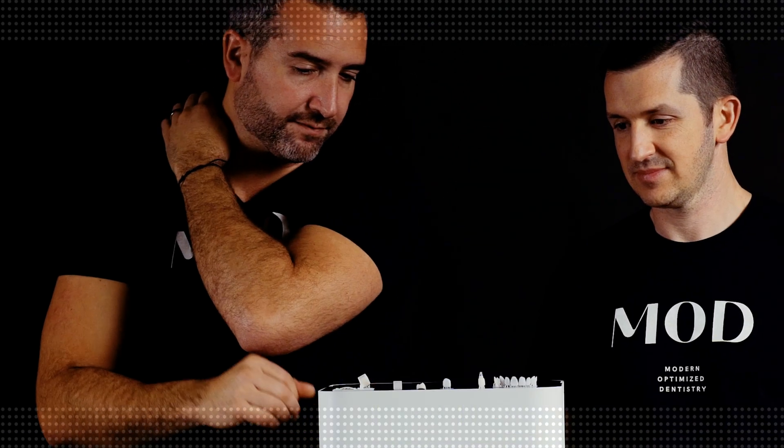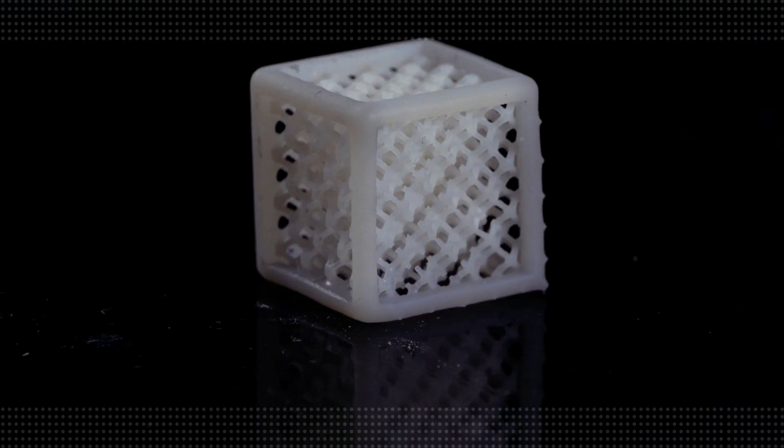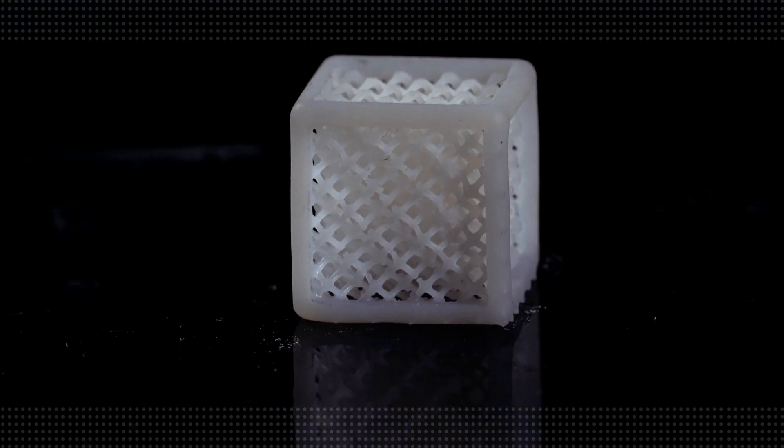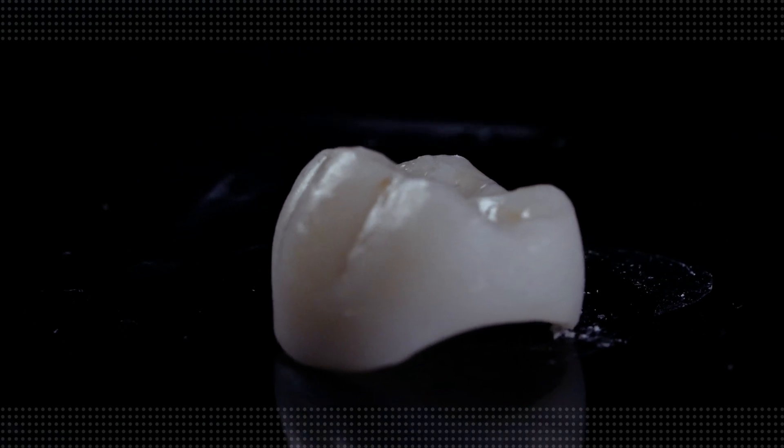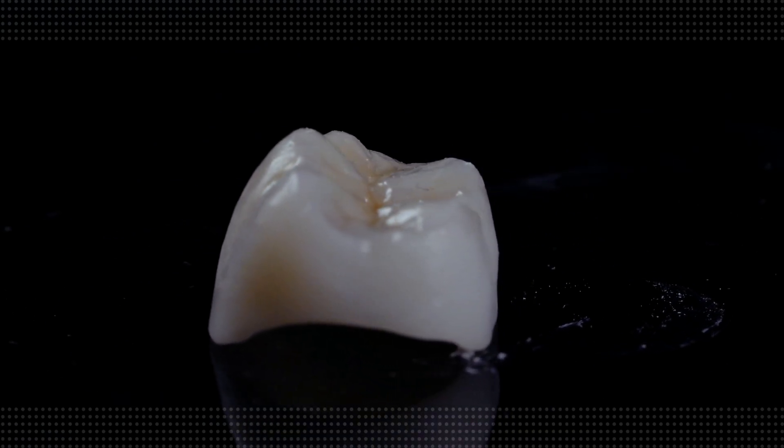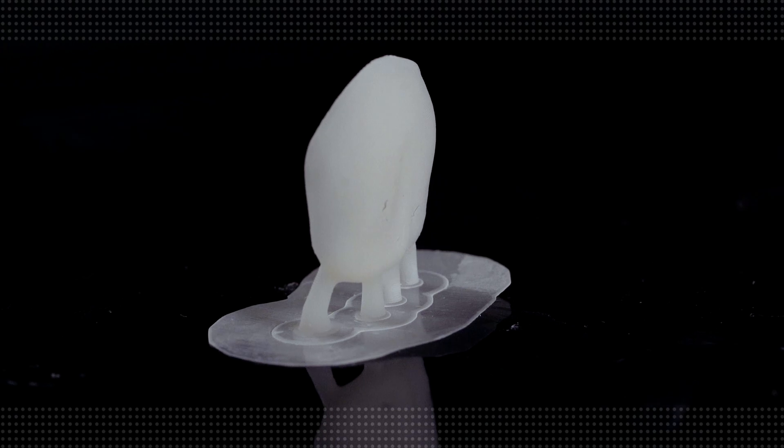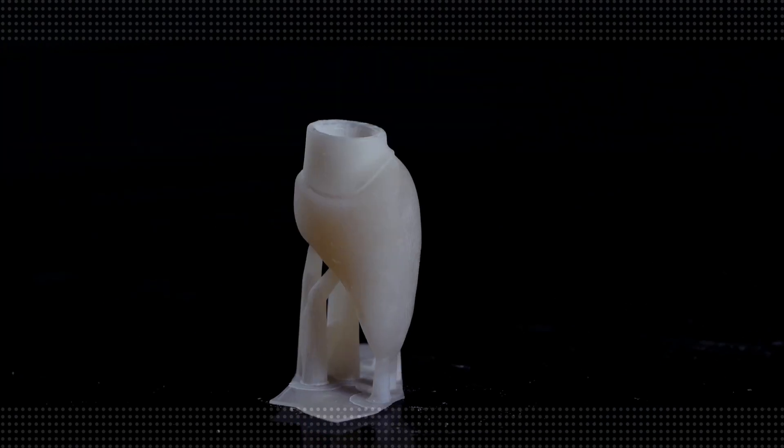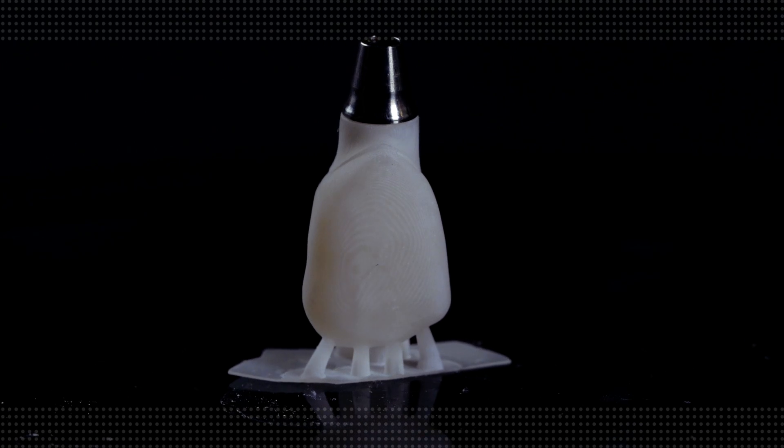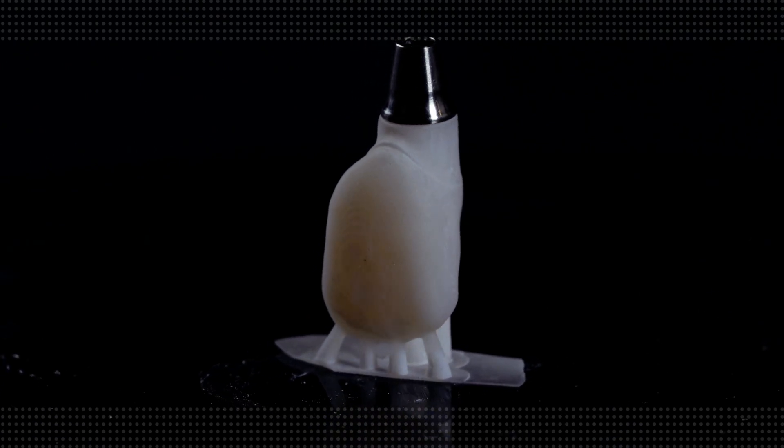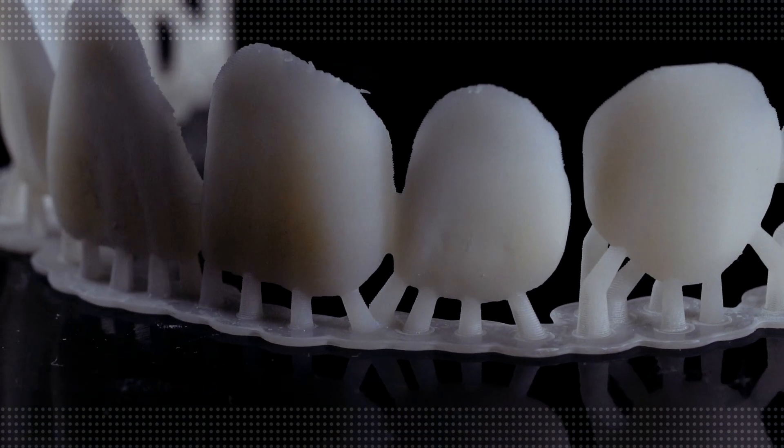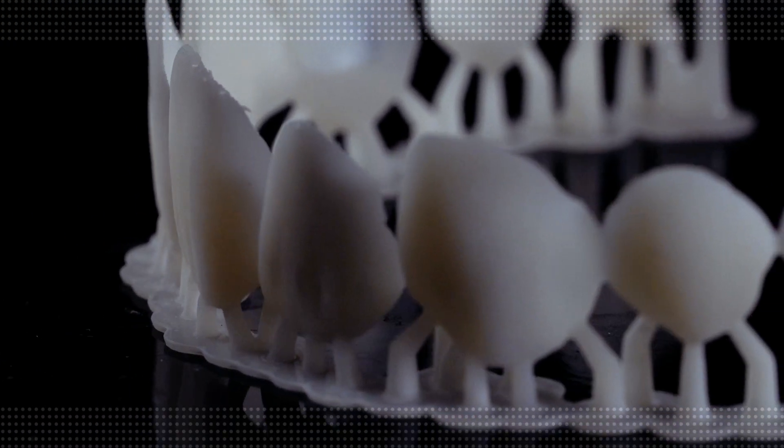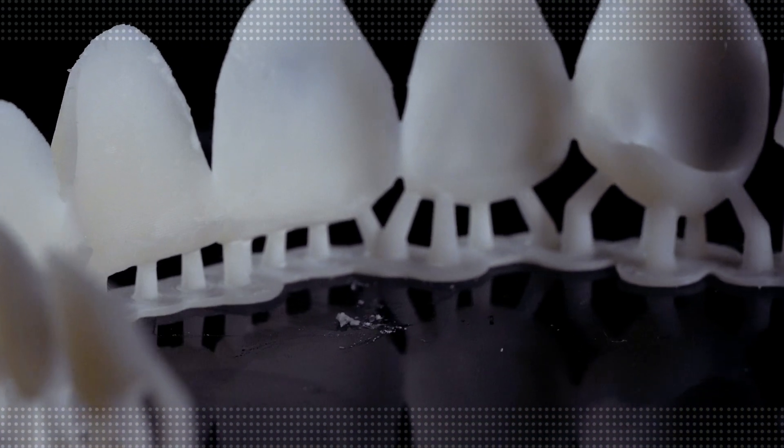The other four benchmarks we have are things that you'll be printing in your office every day. The first one being the single unit crown. Really what we're checking here is occlusal anatomy and margin crispness. Printed really great. The next is a single unit veneer, about 300 microns thick. We checked this on a test die. Perfect fit. So another great print. The third is an implant crown to a tie base. This is a true abutment tie base and we're looking at how well it could print to the anti-rotation notch. It was a perfect fit. We printed that 100 micron cement gap. And the last is a set of show mock-ups that we would print for someone who's looking to try in a new smile. Here we're looking for the accuracy along with the quality of the print for all the veneers and, surprisingly, look amazing.